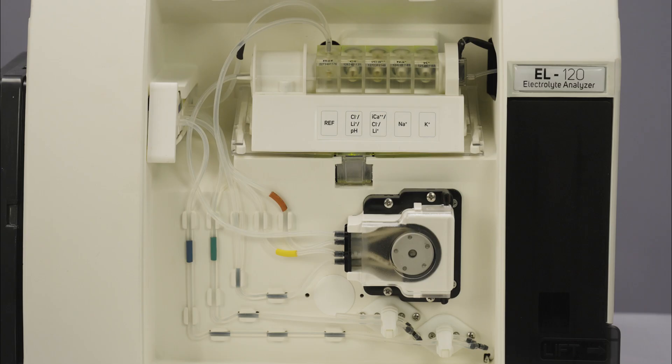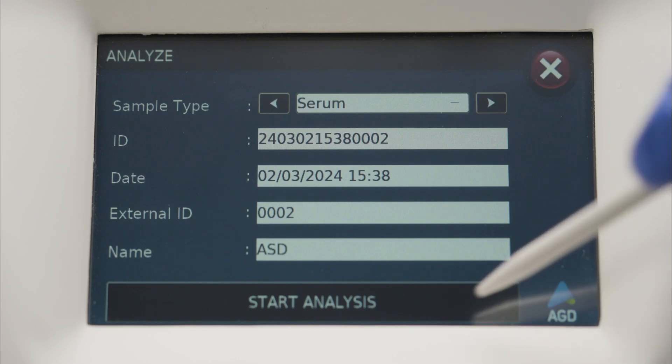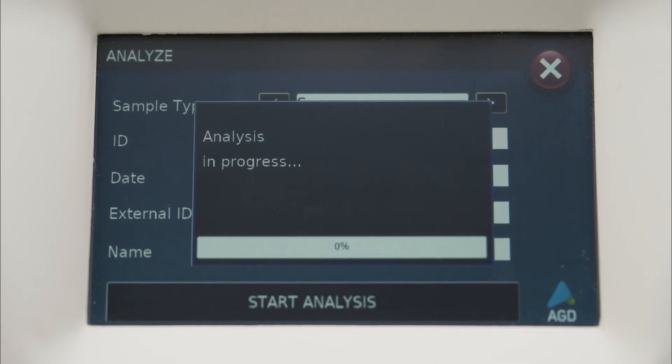The direct ISE method ensures reliable and accurate results for these ions, enabling confident diagnoses and decision-making.